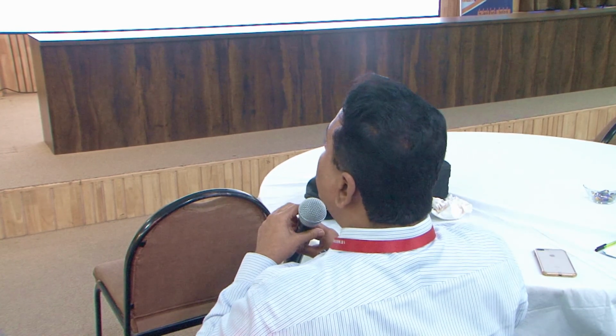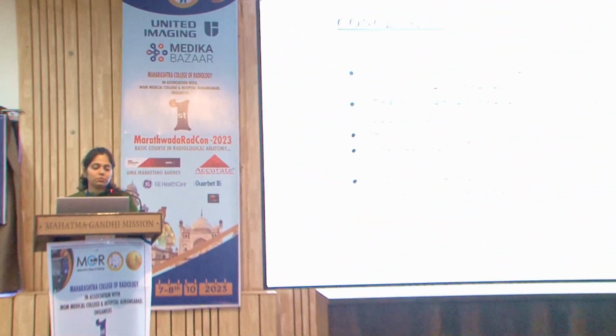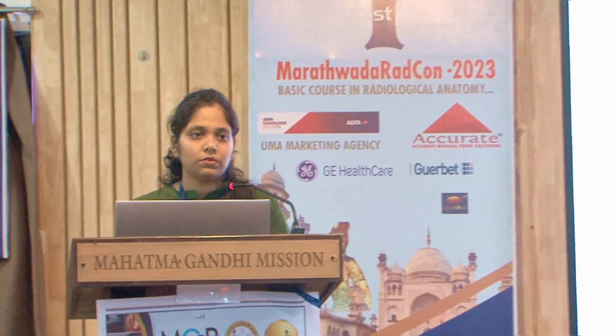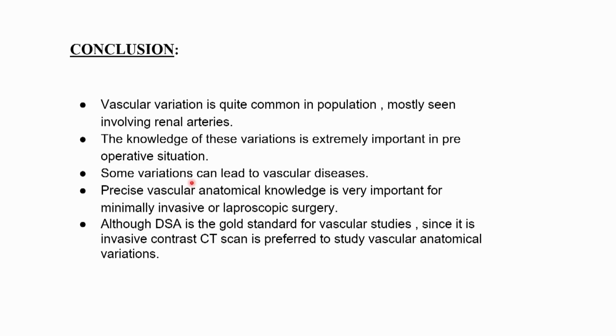For renal and liver transplant, is there a rule that a CT has to be done prior to a liver transplant? Sir, in order to see the vascular variations, we need to, because segmental liver transplant is done, so we need to see the origin of the vessels. Do they always write before a surgeon does, or is it not a mandatory thing? Sir, to answer your question, Rajesh, yes, it is mandatory nowadays.